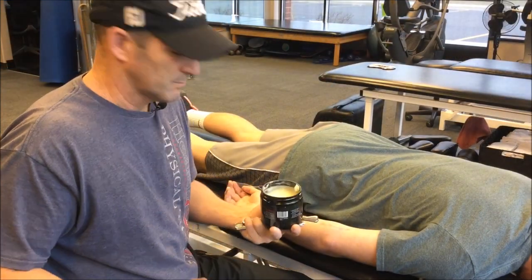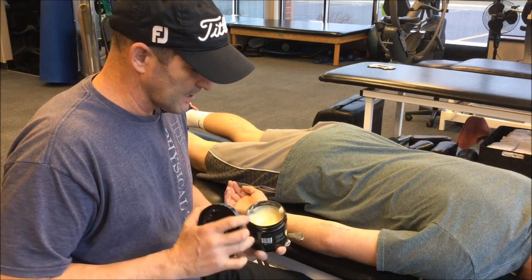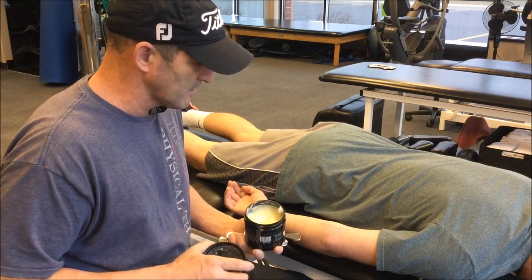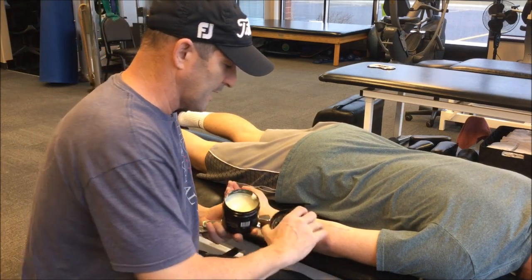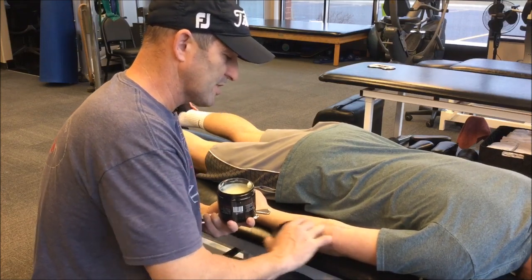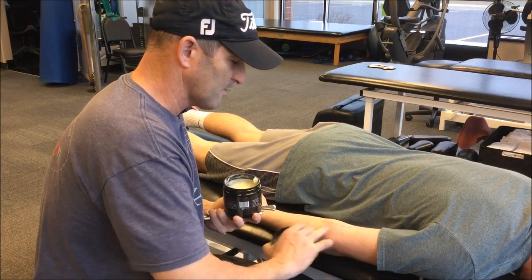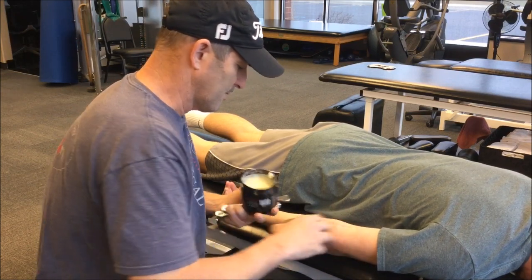I'm going to use RockRub — Graston has their own lubricant, but I like the RockRub because it lasts a little bit longer and it's a little easier to spread out. I'll take a little bit — not too much — because too much gets a little too slippery. You want just enough where you can move the tool, but not so much that it becomes ineffective or you slip too much. So I'll rub it in a little bit.